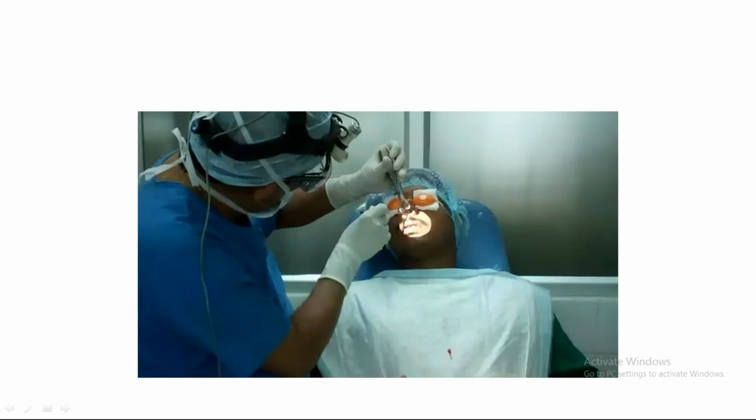This is the position. See, the patient is nicely seated, and we are doing the antral puncture. While introducing the trocar, you hold it like a pen, and then change the grip to a much stronger grip, with a rotatory movement in the direction of the lateral canthus.